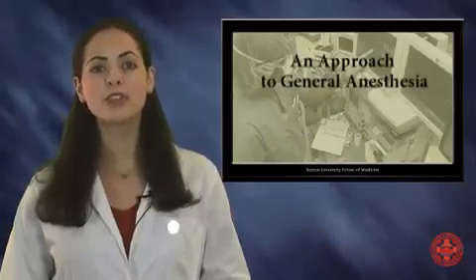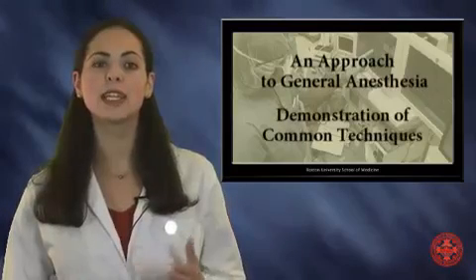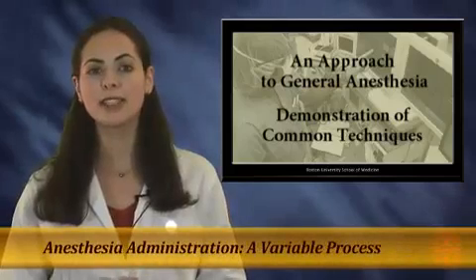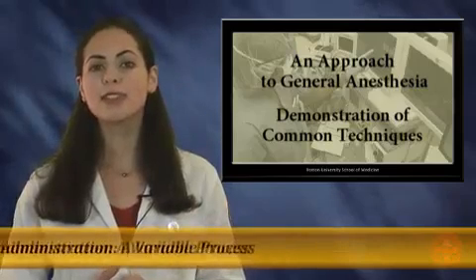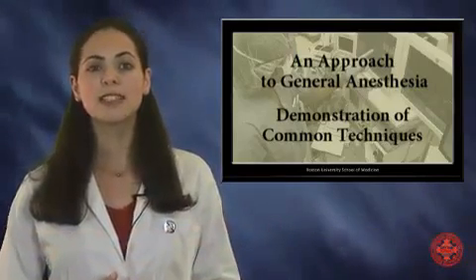The aim of this presentation is to explain an approach to the administration of a general anesthetic with endotracheal intubation, and to demonstrate a few commonly used techniques. While this process varies among anesthesiologists and from one surgical procedure to the next, understanding the basic principles involved is an important first step for beginners in anesthesiology.